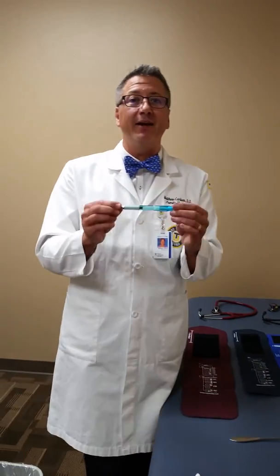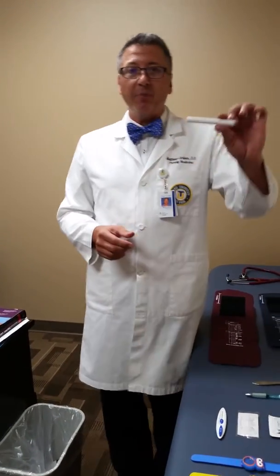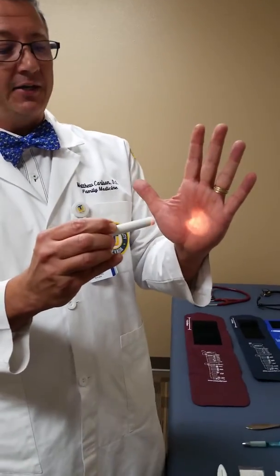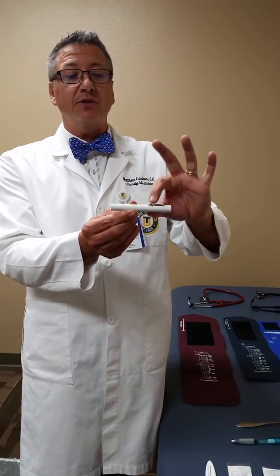You'll notice there's a pen on the table — get yourself a good pen that you like and get a lot of them. The next item is a penlight. A regular flashlight or mag light won't do. As I shine it on my hand, you can see it's bright enough to see details but not bright enough to blind someone. LED versions can be a little too bright for looking at retinas or testing pupillary reflexes, though brighter is fine for the oropharynx. This disposable one has an auto-off button to save batteries and can be found at any medical supply store.